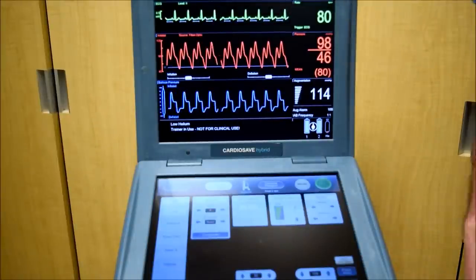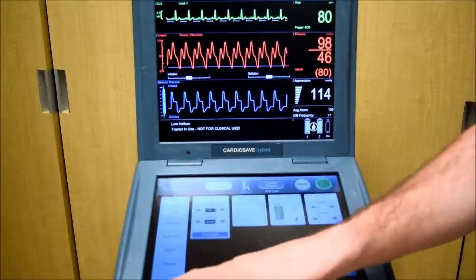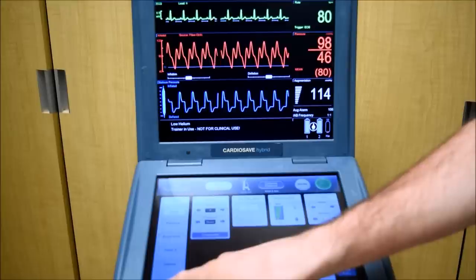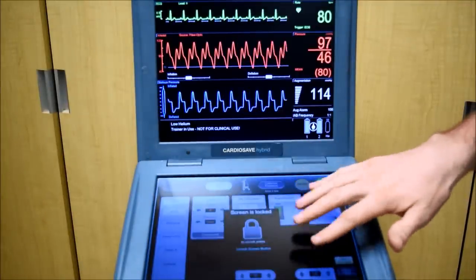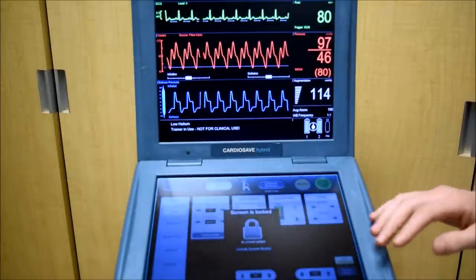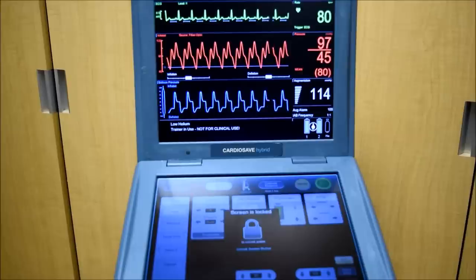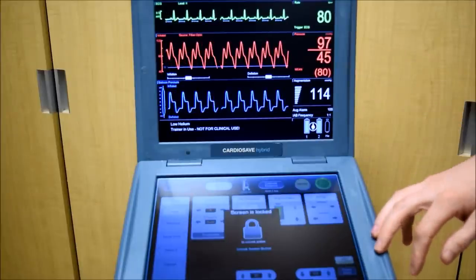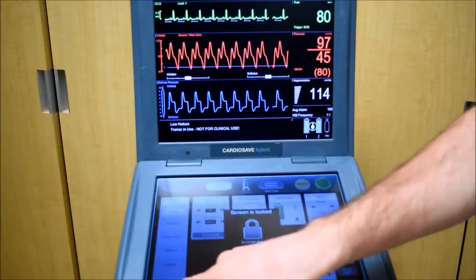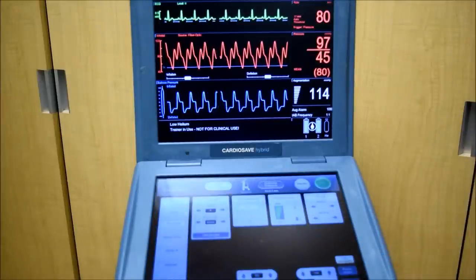If you want to lock the screen to avoid anyone tampering with your settings, press and hold this lock screen button. This will lock the screen so no one passing by can change any of your settings. This locked screen will also appear after a certain amount of time. To unlock the screen, press the unlock screen button in the lower left-hand corner.